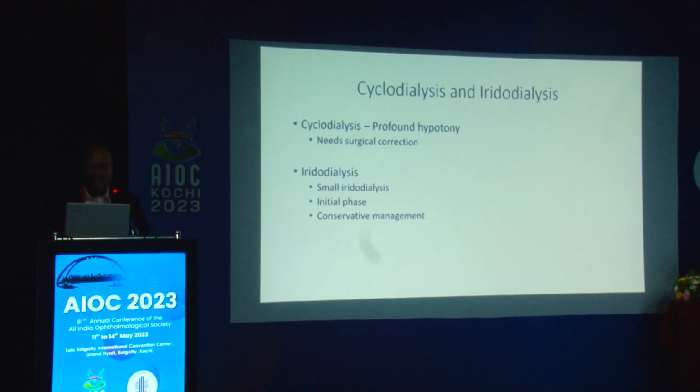I had a patient who had a very POAG but very high lens vault. So I didn't think of it at that time. Retrospectively it hit me when he came for the evaluation. Then I did a scan. I saw his lens thickness was almost 4.9. So I was operating on him as though I was operating on a POAG patient, and it didn't occur to me that he would have a high lens vault.